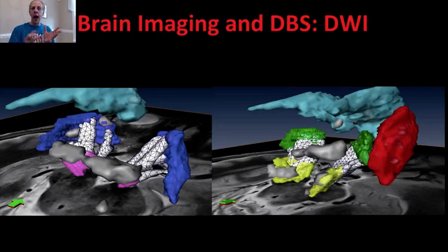You can, of course, add the diffusion weighted imaging that we saw earlier in this video. This is represented here with gray. These are the fibers that we computed. So the neurosurgeon can start thinking, okay, if I touch this region because it's connected to this, then when I put electric pulses there because I inserted my electrode there, that will also affect this region because they're actually connected.